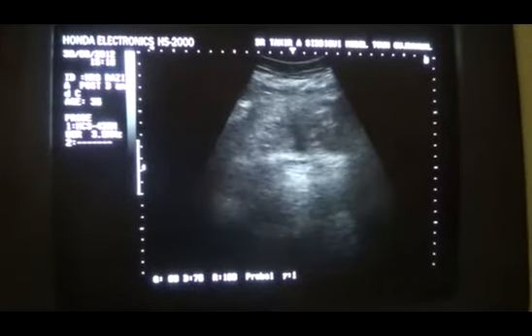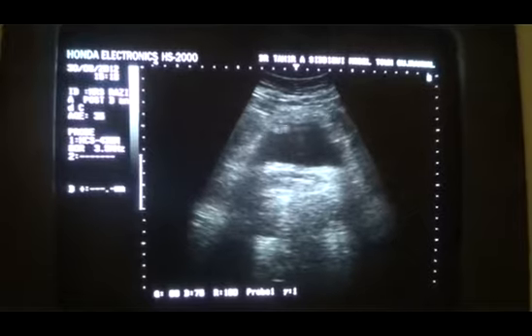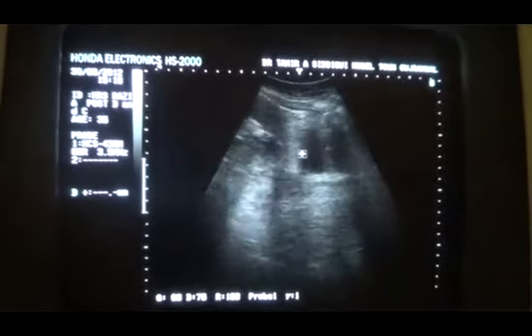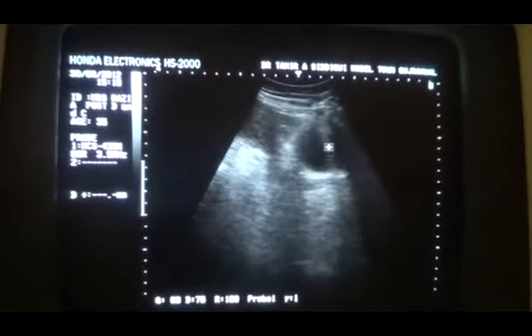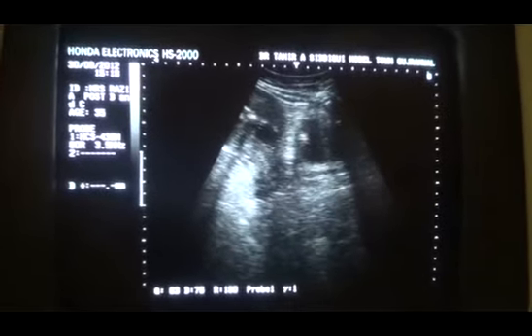This is the urinary bladder in transverse section. This is the urinary bladder in longitudinal section.